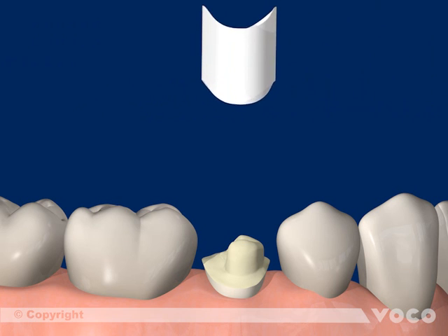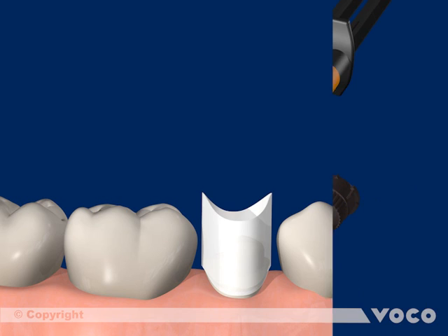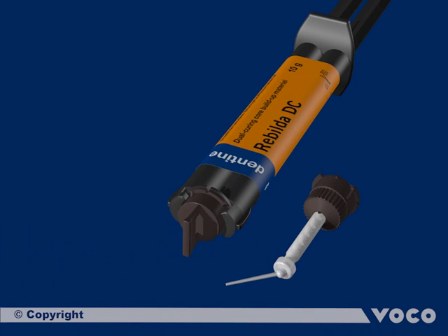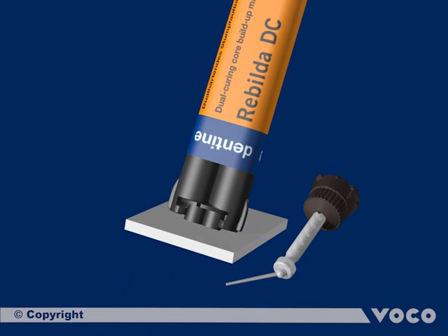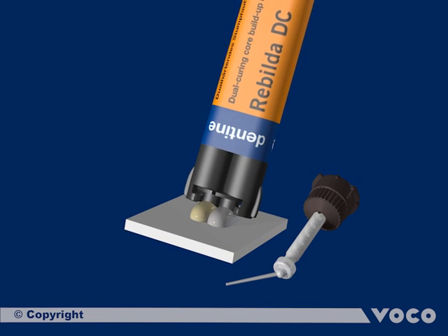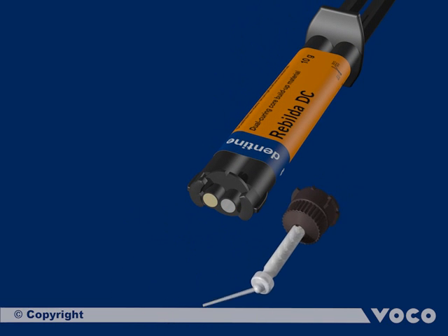The special matrix Rebuilder form can be used for the application of the dual curing Core Build-Up material Rebuilder DC. After attaching the matrix, the quick mix syringe must be bled when used for the first time. This step is always necessary when working with two-chamber syringes to even up the filling level of both chambers.